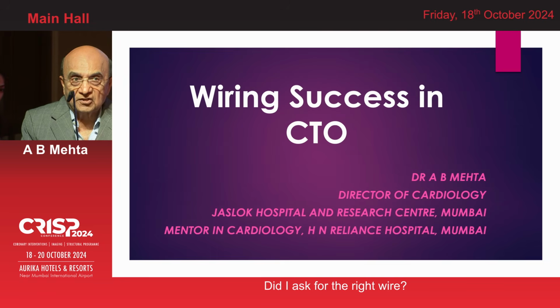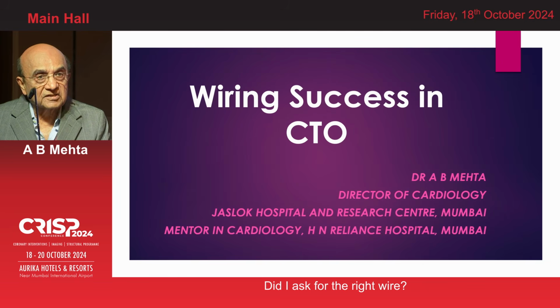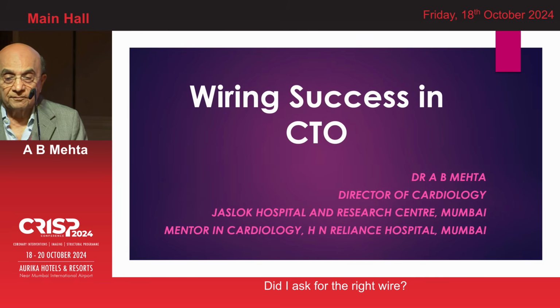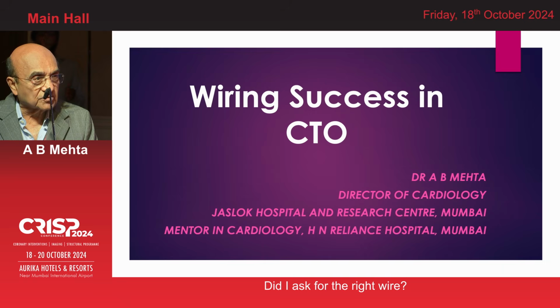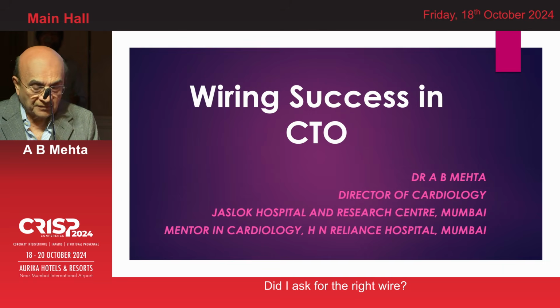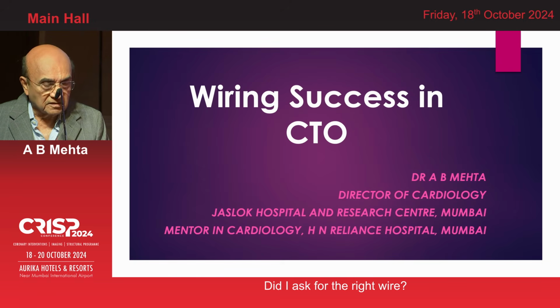Wiring, especially, there are 2 or 3 situations in which wiring is a special subject. One is that whilst you know very well the wire is a railroad, without wire there is no success, there is no angioplasty at all. So wiring is especially a problem or a challenge in a CTO, and sometimes in a jailed side branch in a bifurcation stenting, and sometimes extremely tortuous vessel.